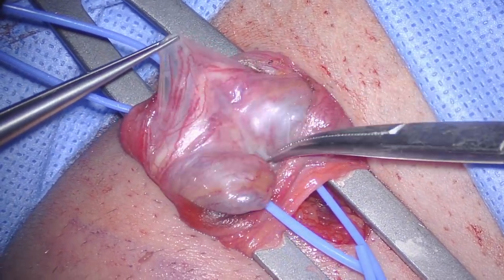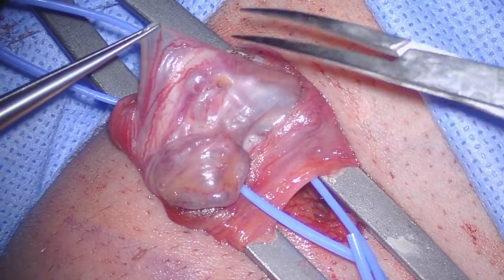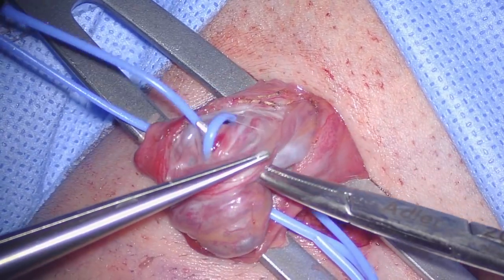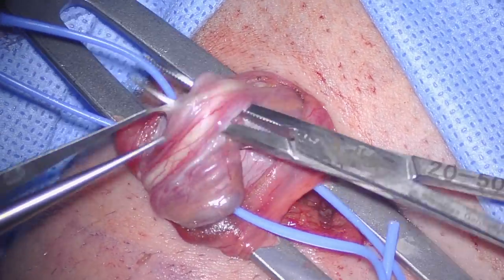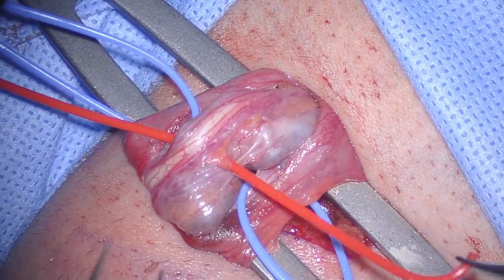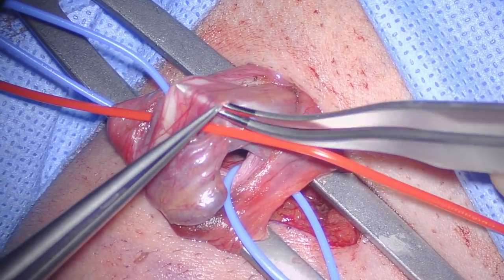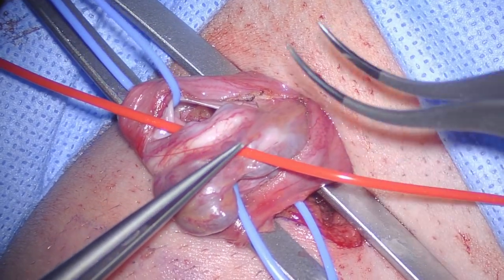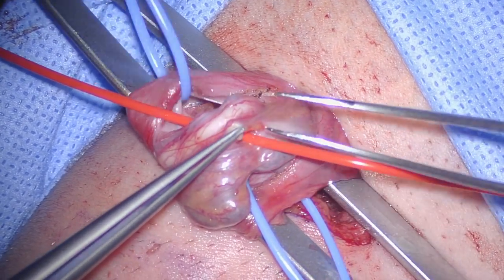The vas is identified and perivasal structures are separated from the spermatic cord. Doppler is used to identify the testicular artery and vasal artery if present. In this patient, no vasal artery was found on Doppler. The perivasal tissue is then dissected and divided with bipolar electrocautery.